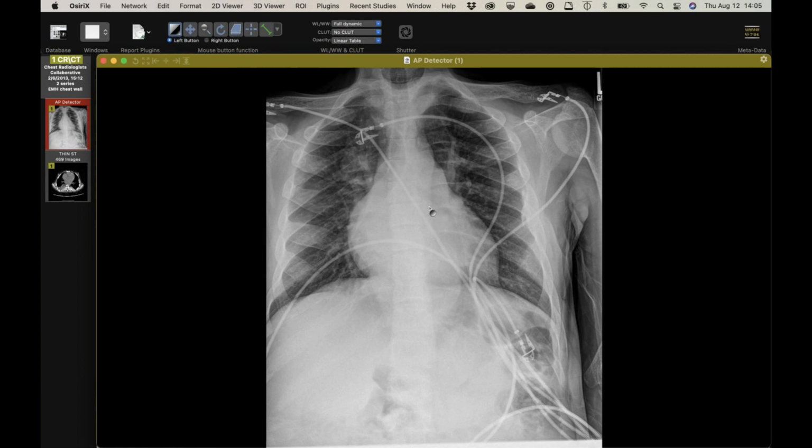Yeah. But what's kind of cool is you can see this extra interface along the mediastinum. There's like a triple density here. So left atrium, presumably, and then some other thing, and then the right atrium or some combination thereof. And there's this extra bump there as well. So you can imagine where this is going to go. But with expanded ribs, bones in general, and funny looking bones, you think about marrow processes.